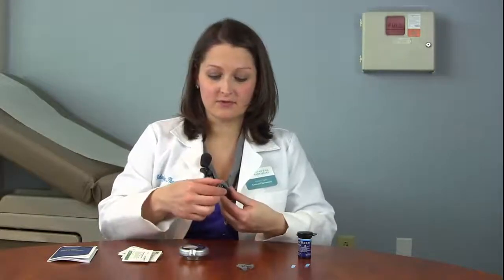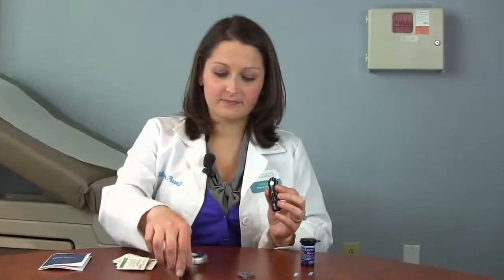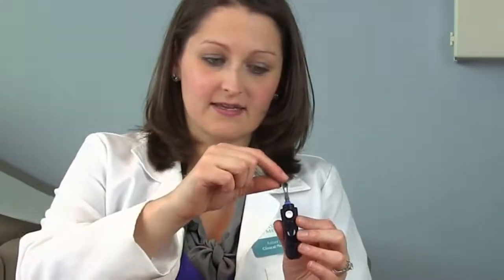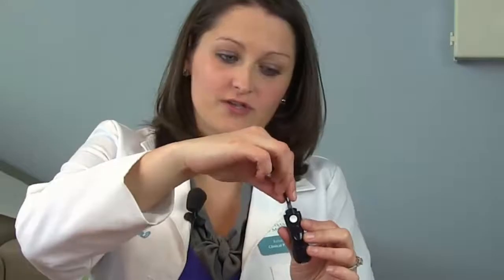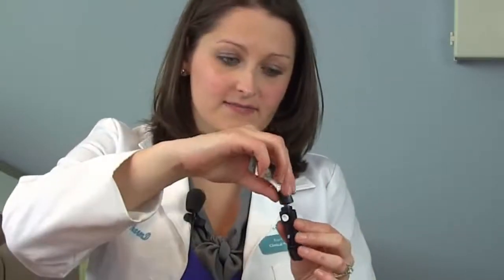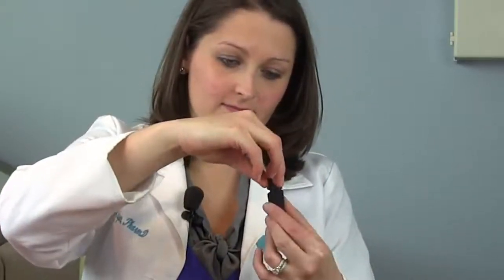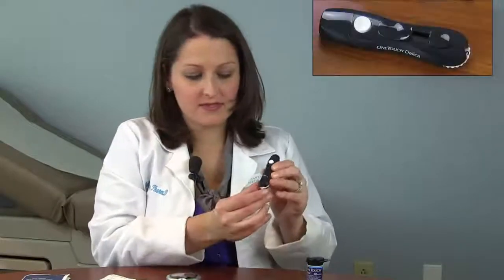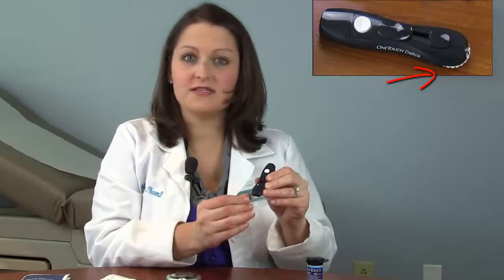The first thing that we need to do is take our lancing device, twist off the top, insert the lancet into the lancing device, and press down. The top of the lancet should then twist off the lancing device. It's important to also note the dial on the bottom of the lancing device can adjust the depth of the needle that's used to prick our finger.